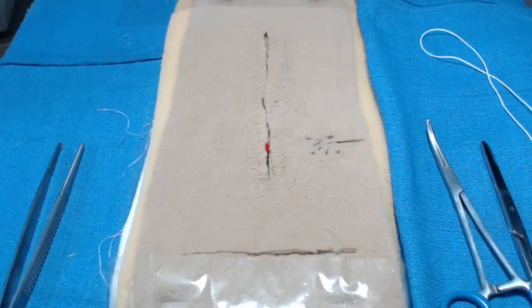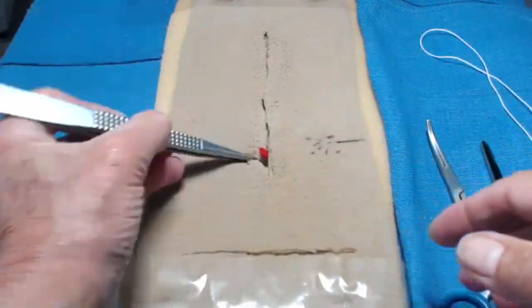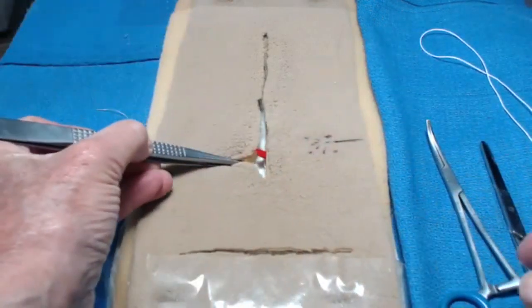I'm going to go to our workspace and do a little demo. Here is my model and that little red dot is the bleeding vessel. I'm going to use my tissue forceps to expose the vessel further so I can see the bleeding coming out of the vessel.